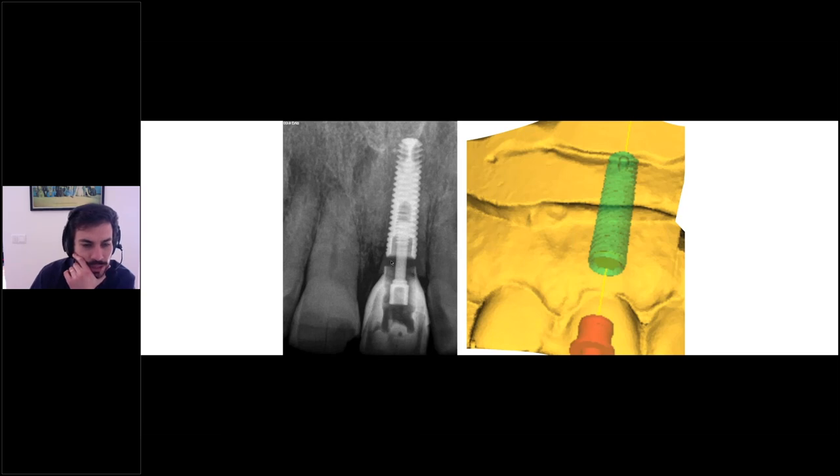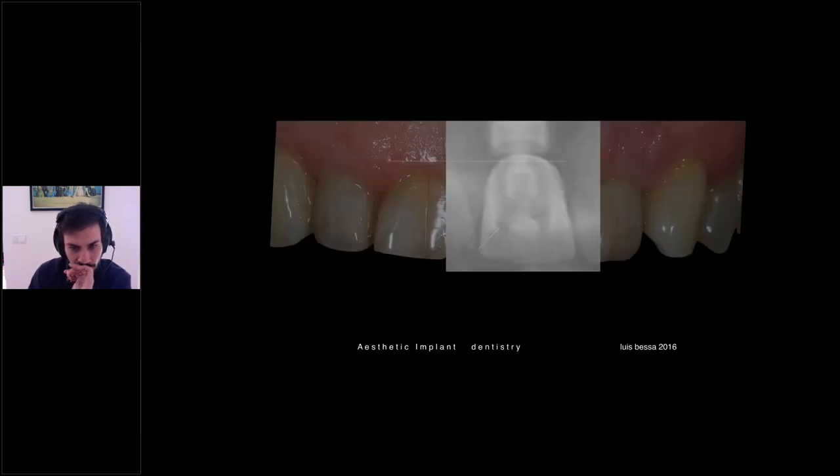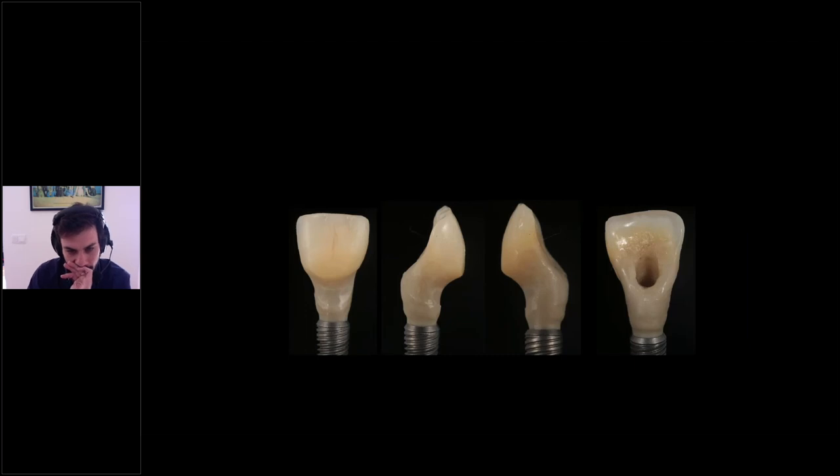I left this case a little bit above the bone. This is an older case. Maybe today I would reduce it a little bit and get a little more space with the bevel that Awi and Jonathan have described. And you can see the implant is a little bit deeper. And then I experienced some internal shield exposure.